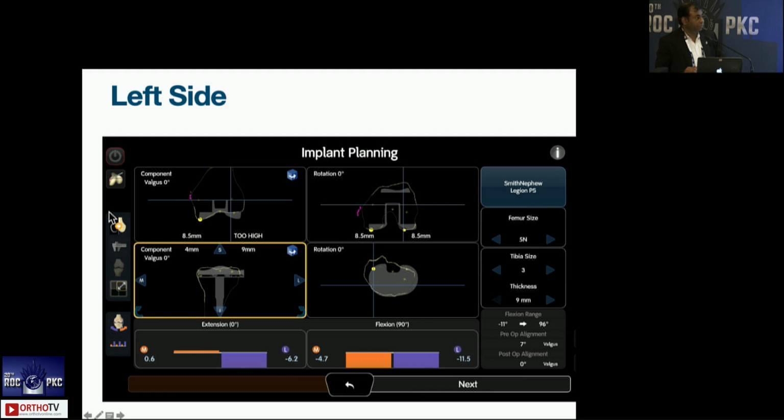So you can actually do lots of things. You can actually shift the femoral component up, or you can actually go from posterior to anterior referencing and increase your flexion space to accommodate the tightness in flexion. But there is differential tightness as well. So there is more tightness on the lateral side as compared to the medial side. You can put the tibia a little bit into valgus, 1 or 2 degrees, and then you can change the femur, and then you will end up doing some releases.